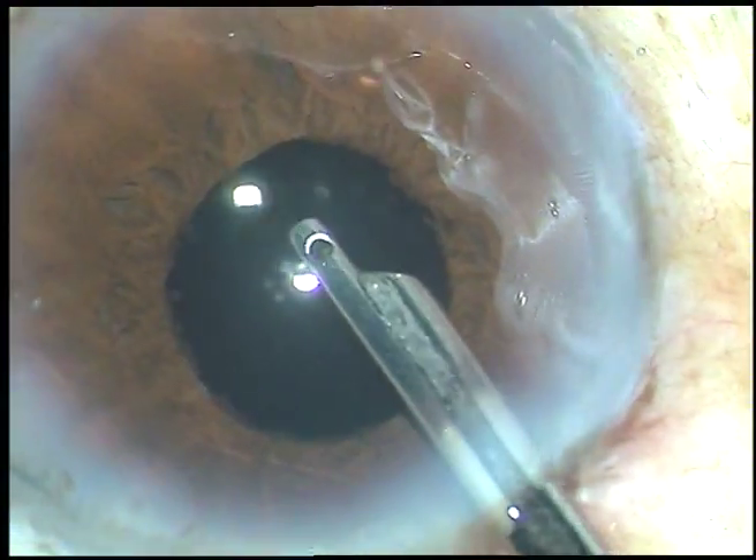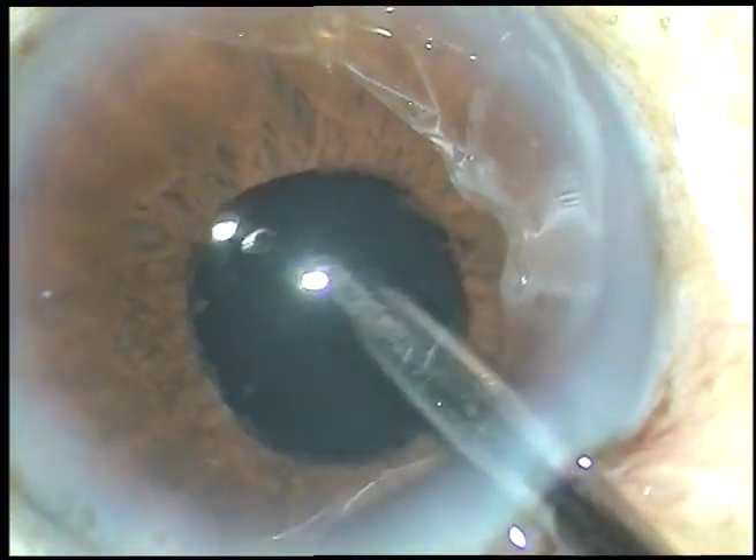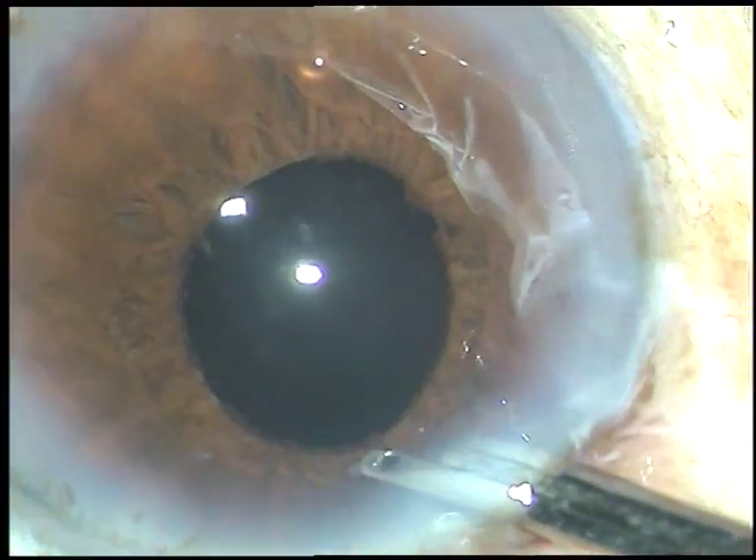So we have managed the case well without any pupil expansion. Thank you very much for watching. Hope this video will help you in developing your surgical skills. Cheers.